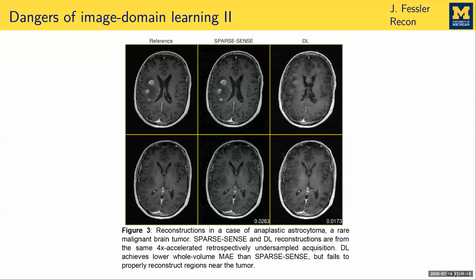So I guess that raises a larger question about the extent to which we can use just straight neural networks in medical applications. As you said, in games it's fine, but if you're going to broaden this to medical applications in general, I think for things like segmentation, registration, other post-processing procedures, there's a lot one can do. Although I'm not a specialist in that, so I'm not going to speculate.